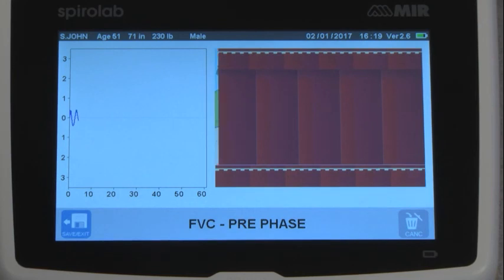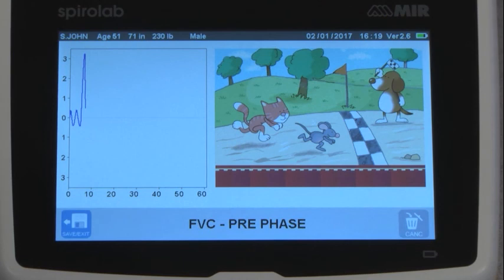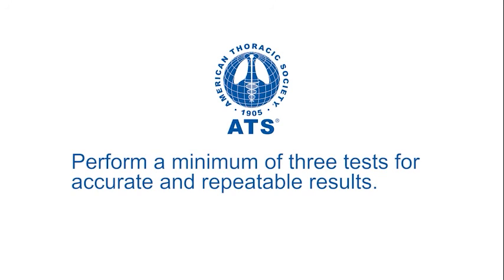The SpiroLab also has an incentive screen that can be used for both pediatric and adult testing to help you get a good result. The American Thoracic Society requires you to do a minimum of three tests to get accurate and repeatable results.